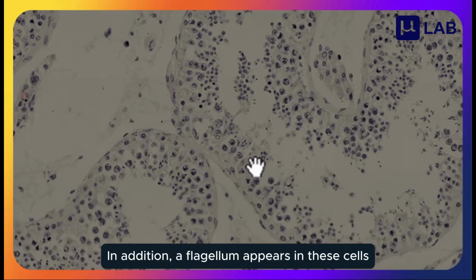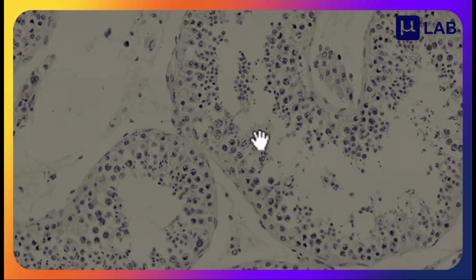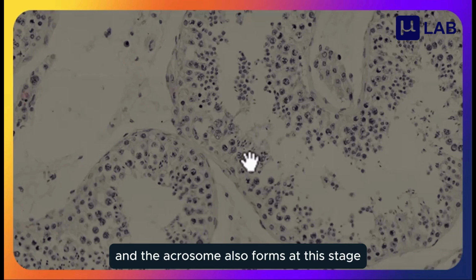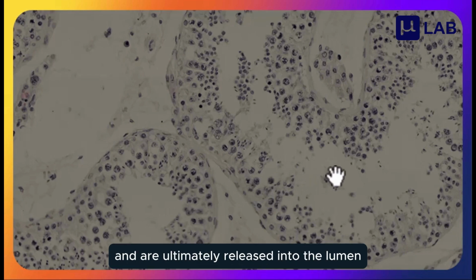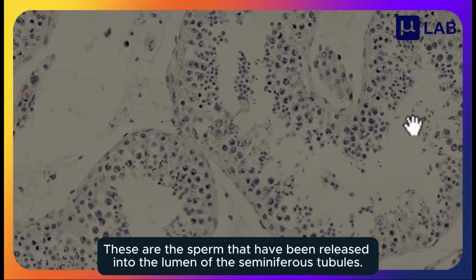In addition, a flagellum appears in these cells. And the acrosome also forms at this stage. In this way, mature sperm are produced. They are located toward the lumen and are ultimately released into the lumen. These are the sperm that have been released into the lumen of the seminiferous tubules.